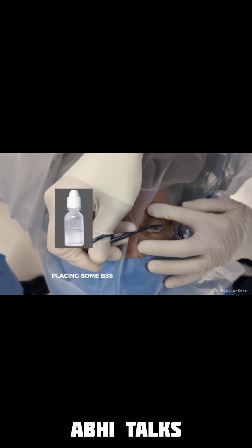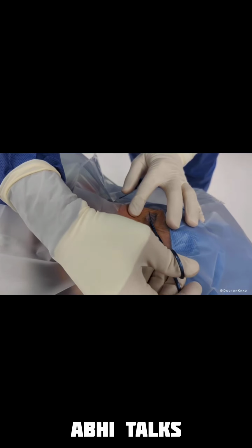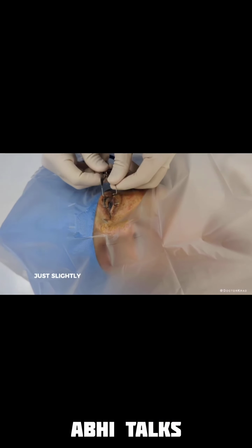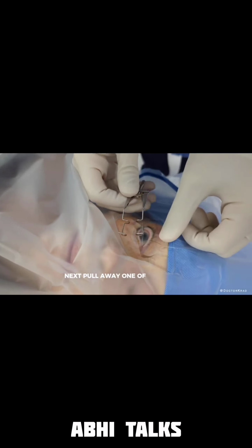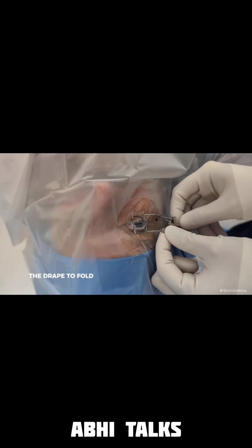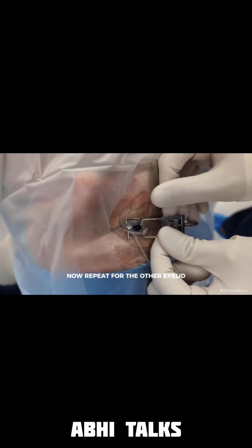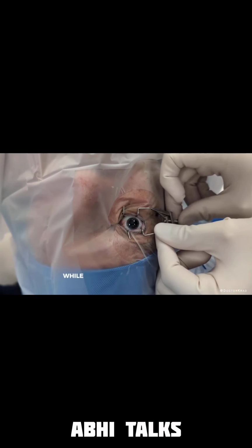Placing some BSS within the slit can help protect the cornea, and it also helps the scissors glide through the adhesive. After the slit has been created, open the eyelid speculum just slightly wider than the interpalpebral width. Next, pull away one of the eyelids and slide in the lid speculum in a manner that causes the drape to fold over and around the eyelid margin. Now repeat for the other eyelid. Then you can adjust the tension of the speculum to open the eyelid as much as necessary while maintaining patient comfort.